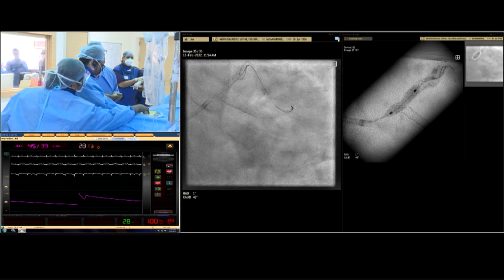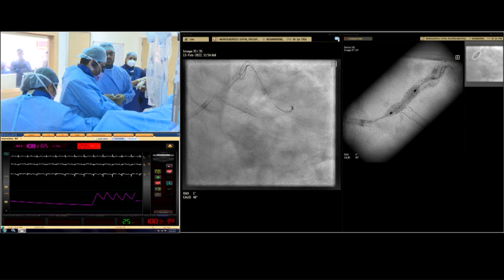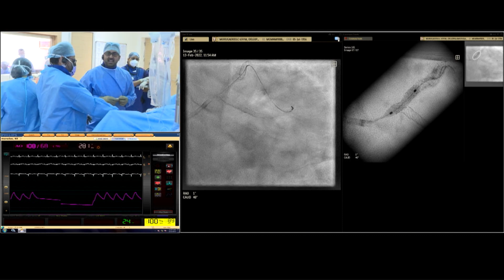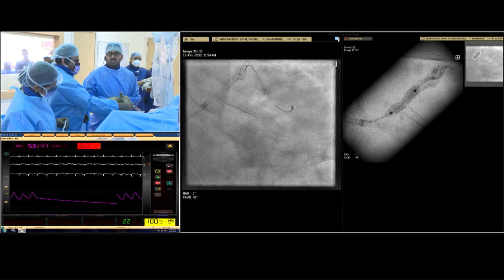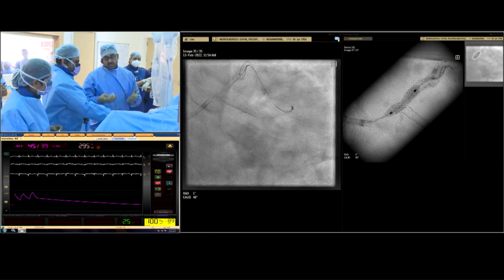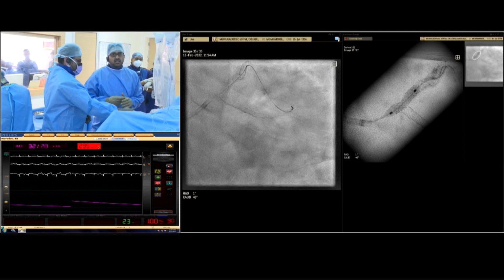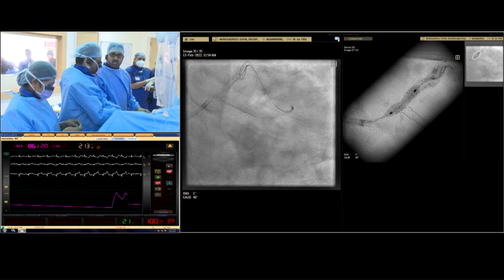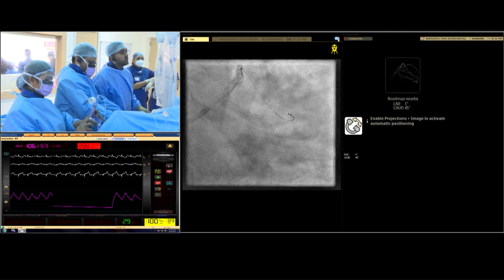But here we had a few issues which I didn't show or spend time on in detail, because every time I went up with the balloon at the ostial LAD and left main, the pressure went down significantly. The patient didn't tolerate it. So we had to take the balloon out after 3 cycles and somehow reintroduce it. And that, of course, invites more dissections, acute vessel closure and all that. Something to bear in mind just for the viewers.